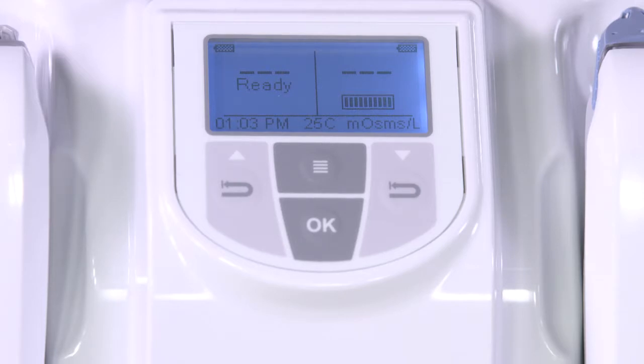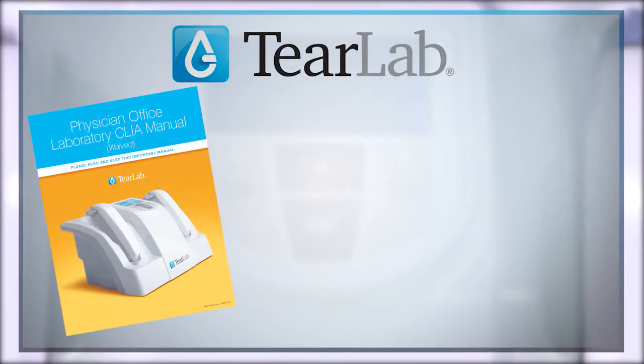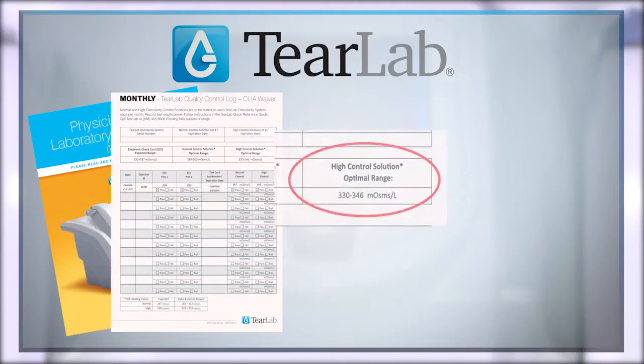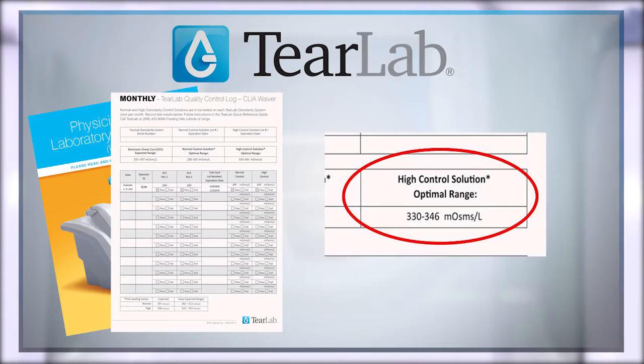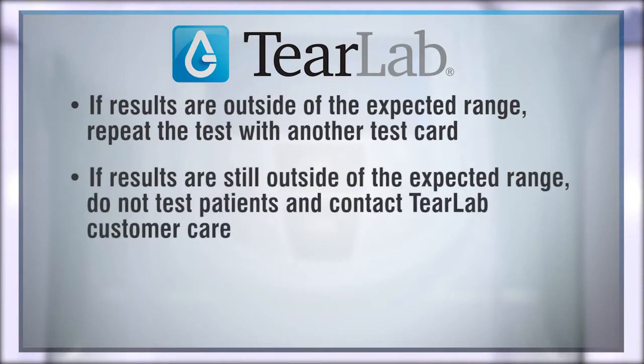Verify that the LCD reading matches the expected value in the instructions for use. Optimal readings should fall within plus or minus eight milliosmoles per liter. If results are outside of the expected range, repeat the test with another test card. If results are still outside the expected range, do not test patients and contact TierLab customer care.